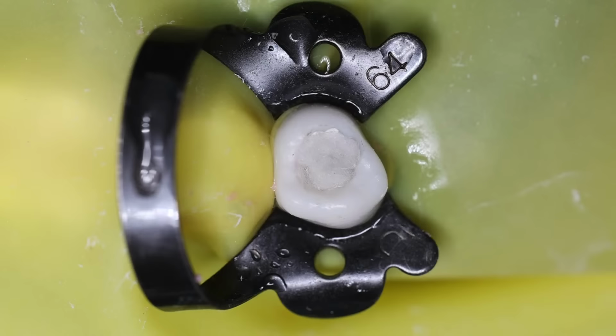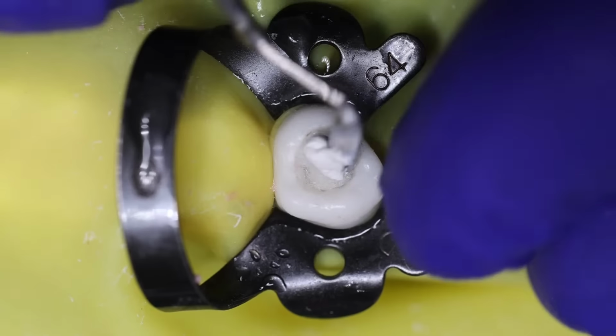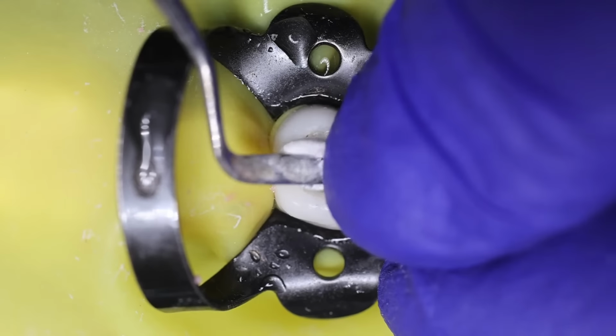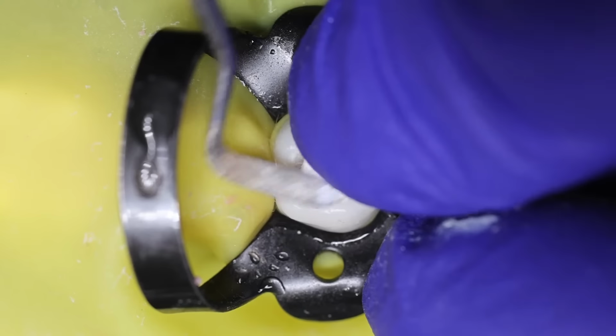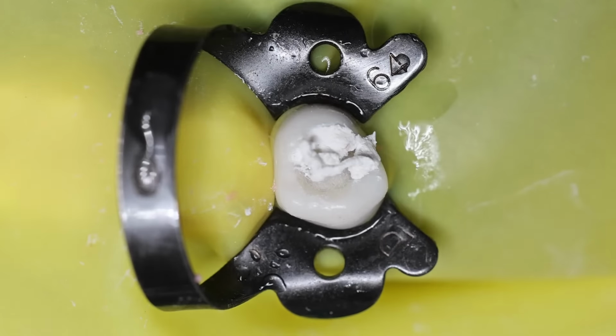Let it be. Okay, so now after placing the cotton, you can place a temporary restoration over it, and not any GIC or anything, just a temporary restoration can be placed. I will just condense it.